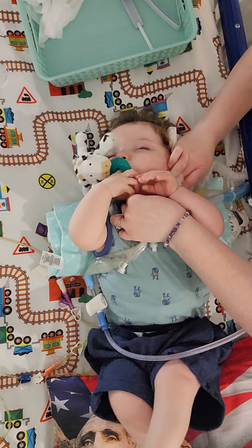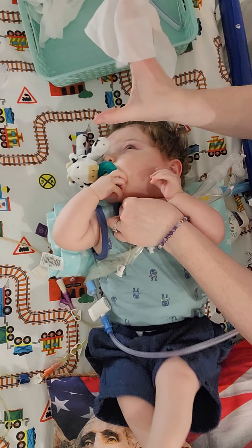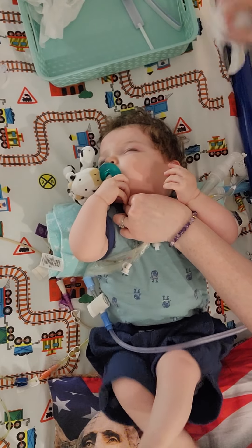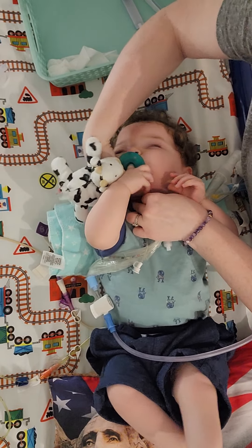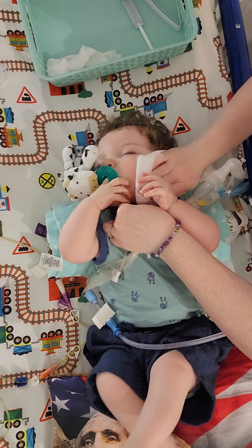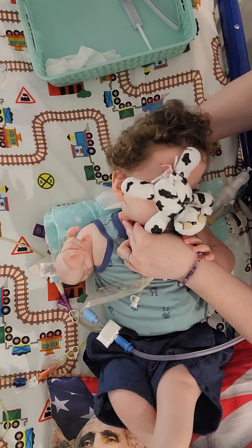That's the trach tie out. Now I take the wipe — it has a fragrance but he is not bothered by it. You could use a more sensitive wipe if they have eczema. The hardest part doing it by yourself is I use my thumb to lift him up and then use my fingers to get into the neck. He doesn't necessarily lift his head up to help me, but he's used to the routine. Now I dry it with the lint-free cleaner, making sure it's not wet or damp back there.